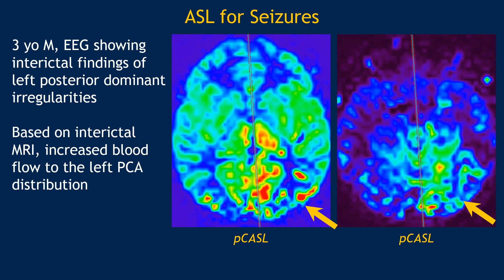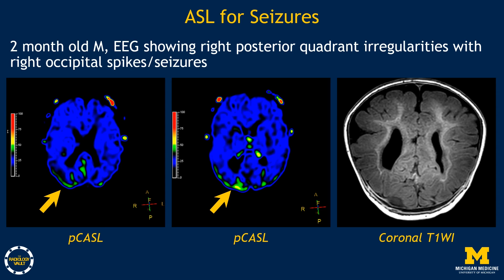ASL can also be used for seizures. A young three-year-old had EEG showing interictal findings of left posterior dominant irregularities, and ASL showed increased perfusion or increased blood flow to the left posterior PCA territory. Another young child at two months of age showed right posterior quadrant irregularities on EEG, with elevated perfusion into the right occipital lobe. On T1-weighted coronal imaging, the brain was very unusual, showing a lot of dysplastic cortices.